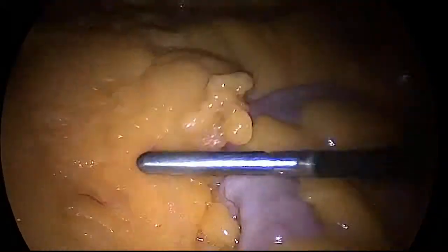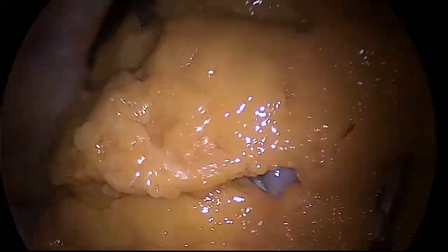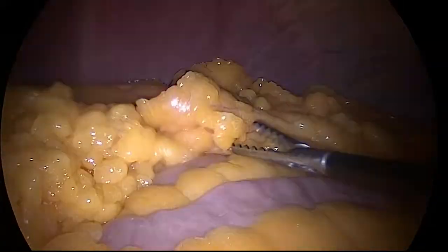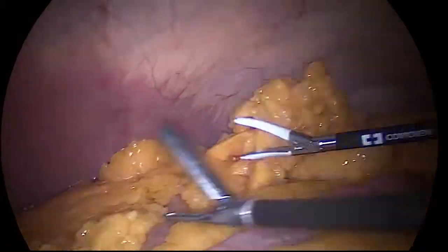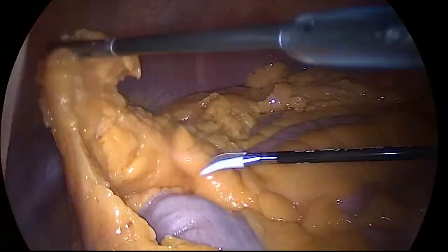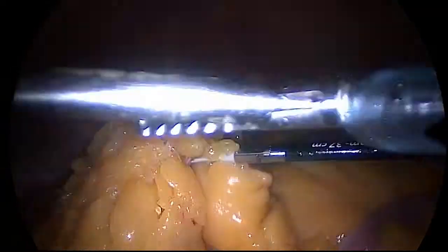The omentum is mobilized, as you can see, for suturing of the omentum up into the upper quadrants. An energy device is used to take down any attachments of the omentum to make sure we achieve good hemostasis. Omentum attachments to the colonic wall here, as you can see, are also taken down and reduced.